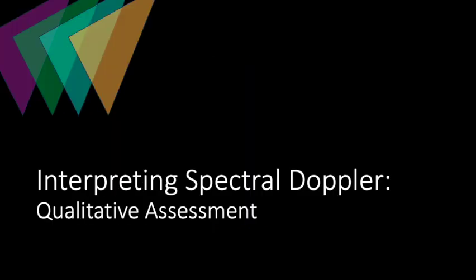After we've generated a spectral Doppler waveform, we can assess the waveform both qualitatively and quantitatively. When I say we can assess it qualitatively, what I mean is that we can use its sound, its shape, and its appearance to draw conclusions. Let's start by taking a quick look at some of the ways we can qualitatively assess spectral Doppler waveforms.